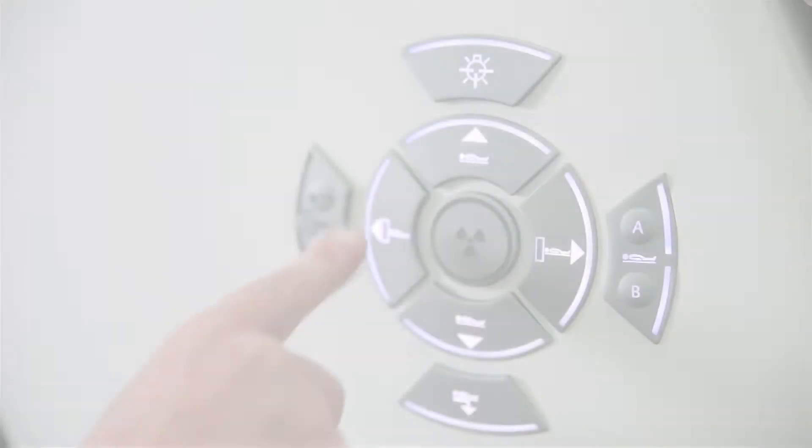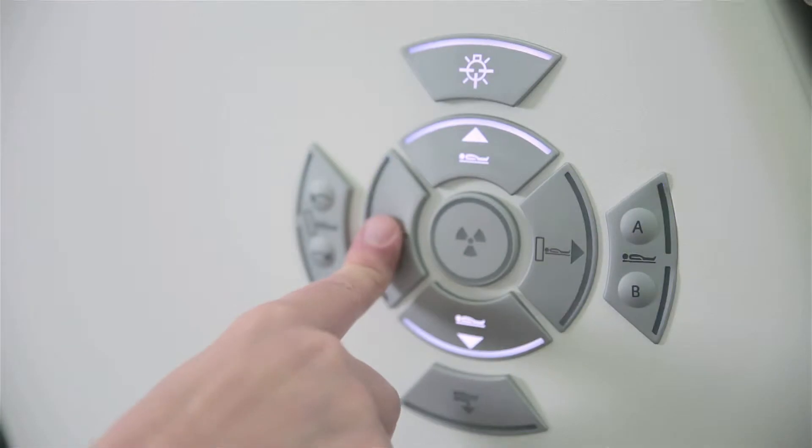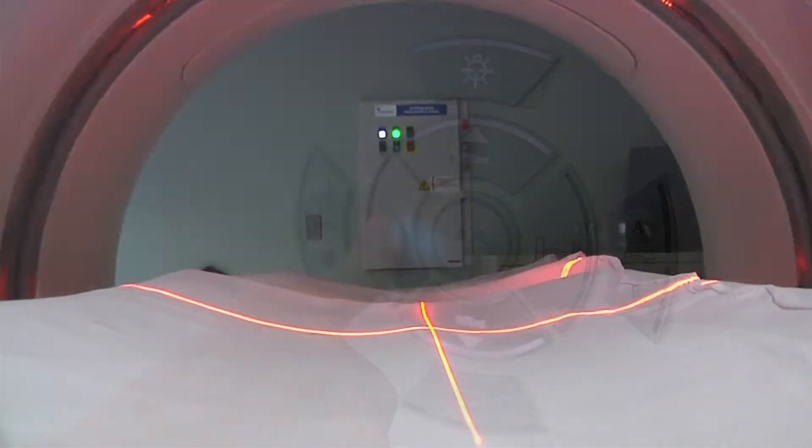Multi-slice CT is really a modern CT scanner which pretty much everyone uses. That allows us to acquire the 3D data to reconstruct the x-ray images of the inside of the knee much more efficiently. So really all of the CT we do now are all multi-slice CTs.